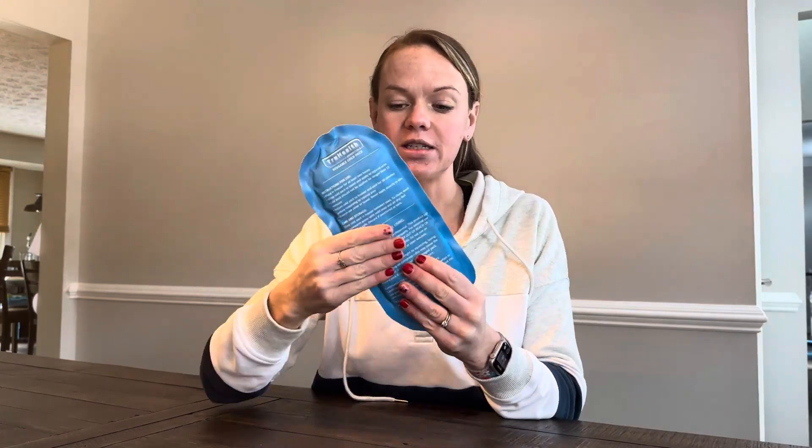I've been using these for three years and they've held up super well. If you're looking for a reusable ice pack, I highly recommend these ones.